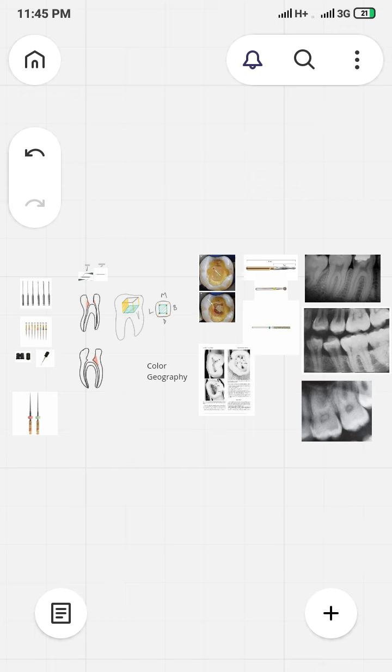I wanted to share some of the things that I learned to avoid those mistakes, and hopefully this information will come in handy for those who are starting out, because I think most of the people who have been doing root canals or in practice for 2 or 3 years already know whatever I'll be talking about in this video. So maybe mainly the students who are starting out as interns or starting their practice soon will get the most benefit out of this video.